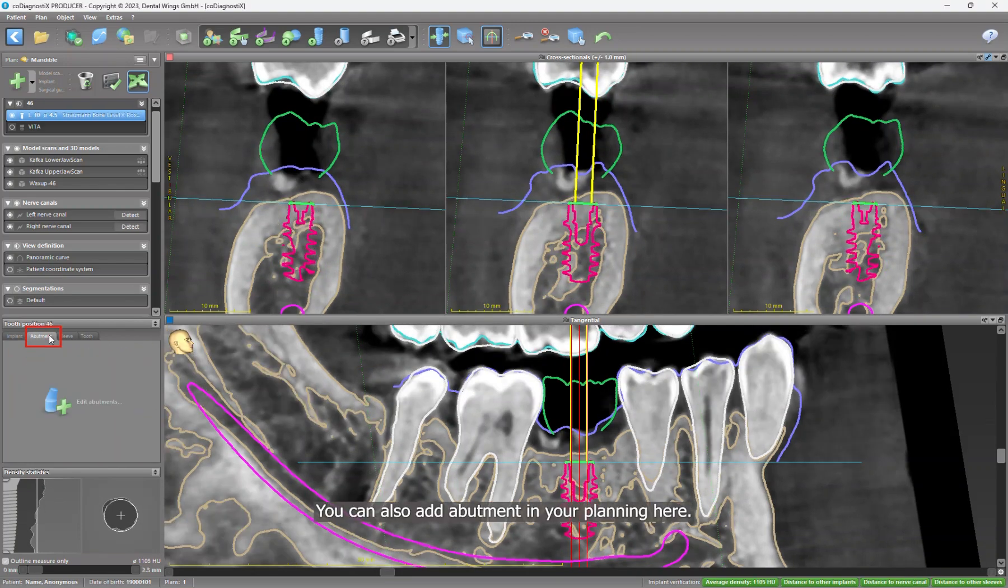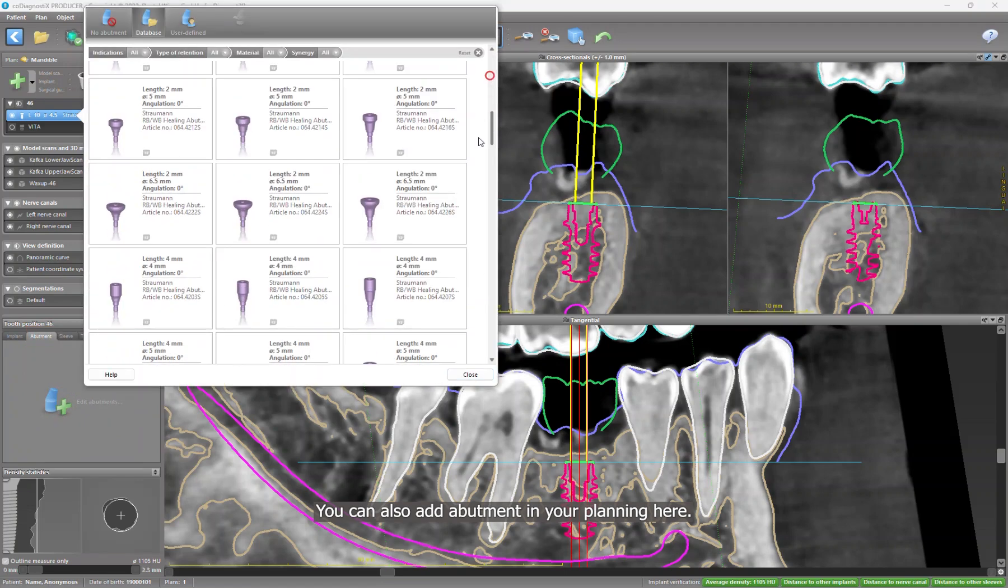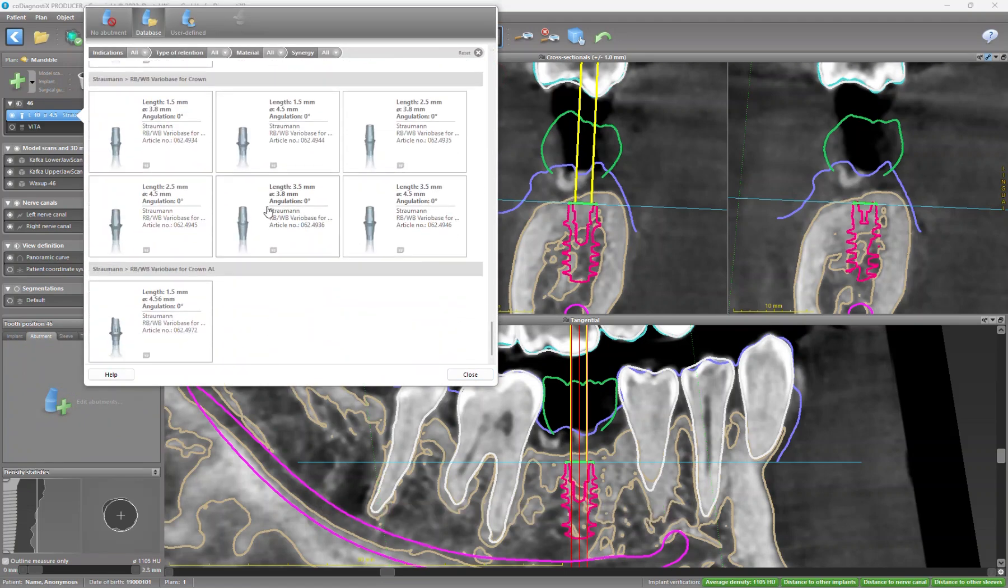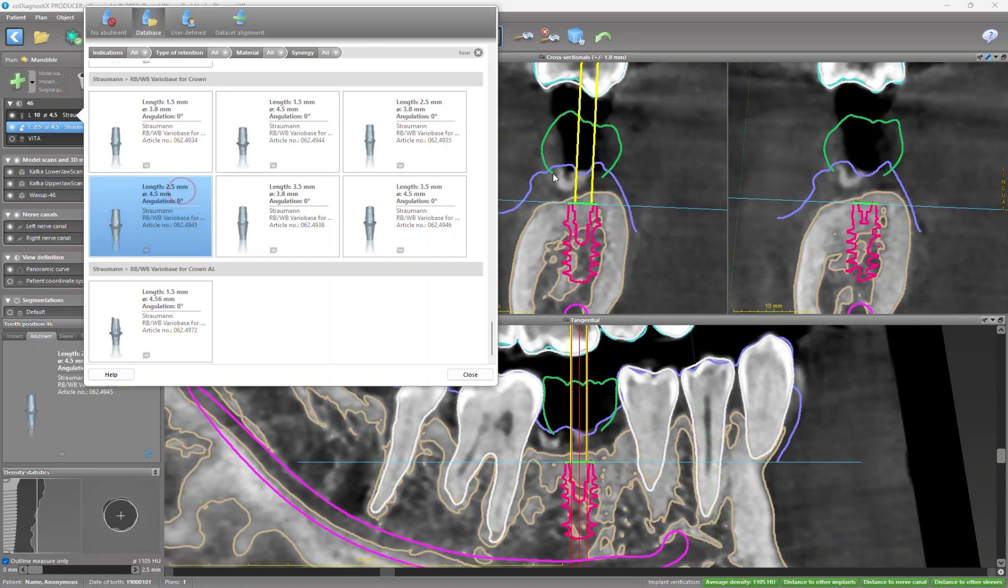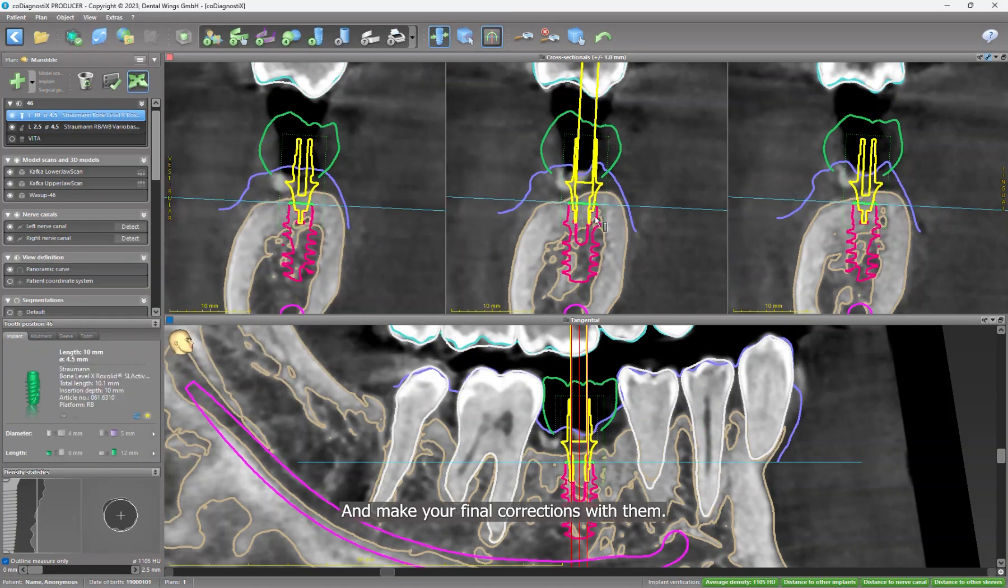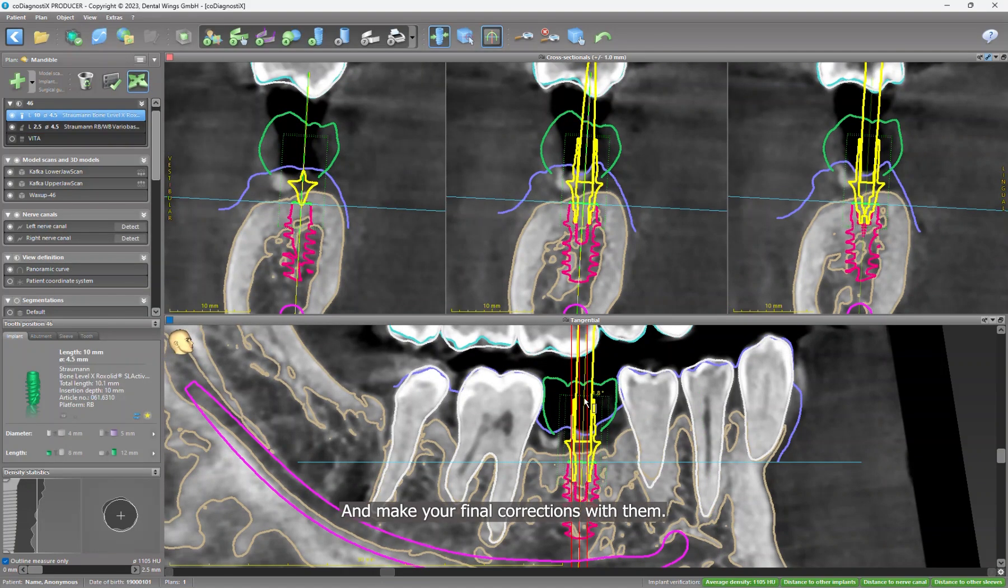You can also add abutment in your plan here and make your final corrections with them.